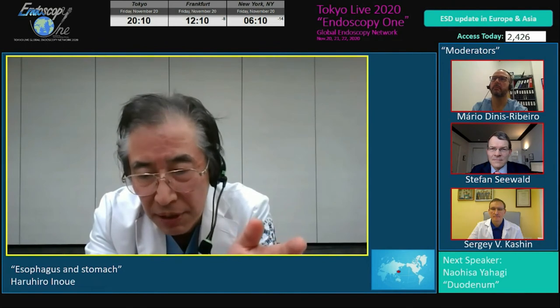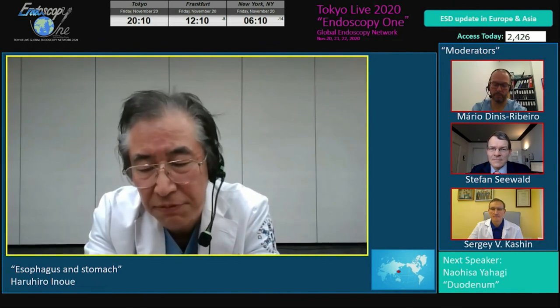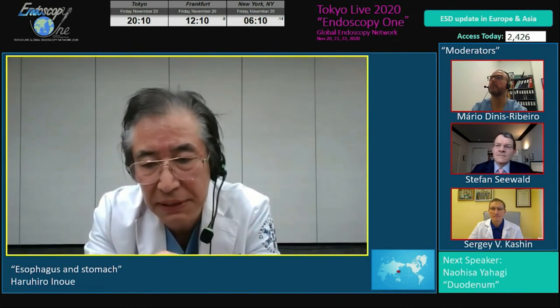So POEM is totally different. At the time of POEM, we approach very closely to the muscle layer, or sometimes we dissect the muscle surface. So that's the difference. Thank you.